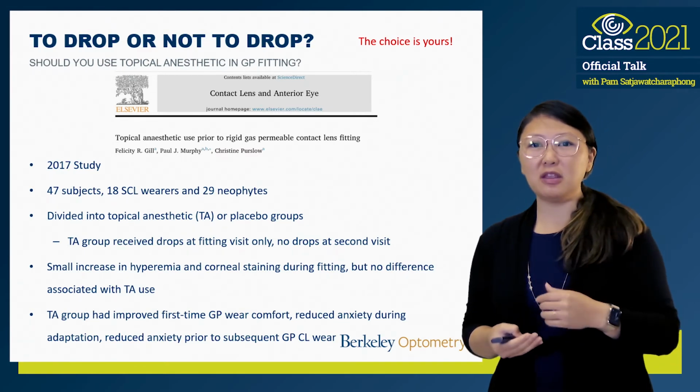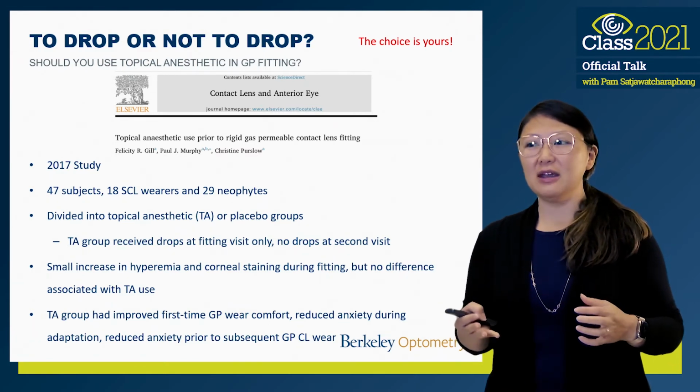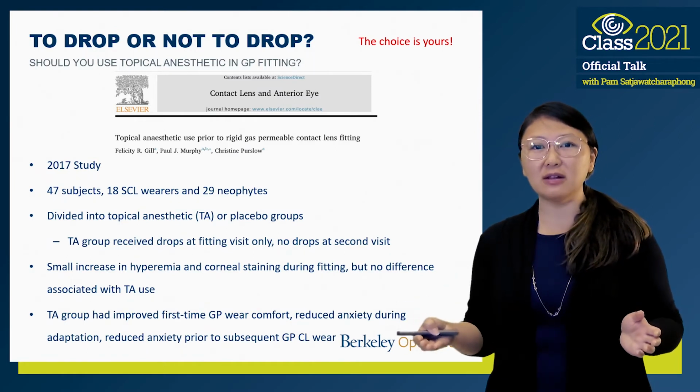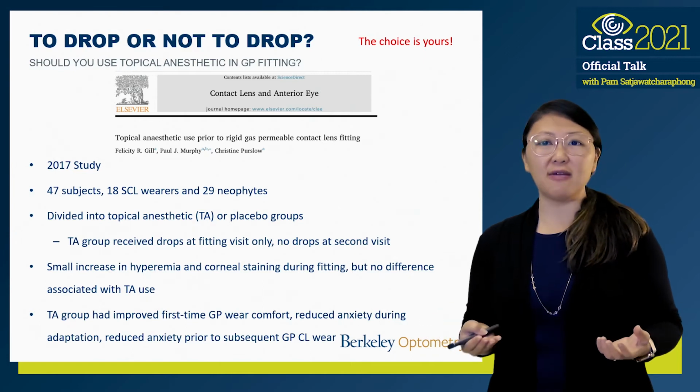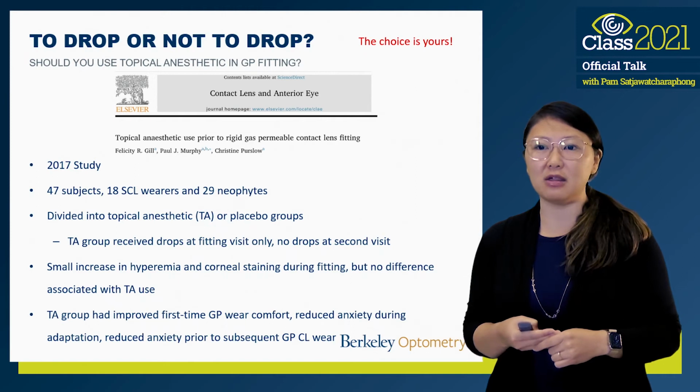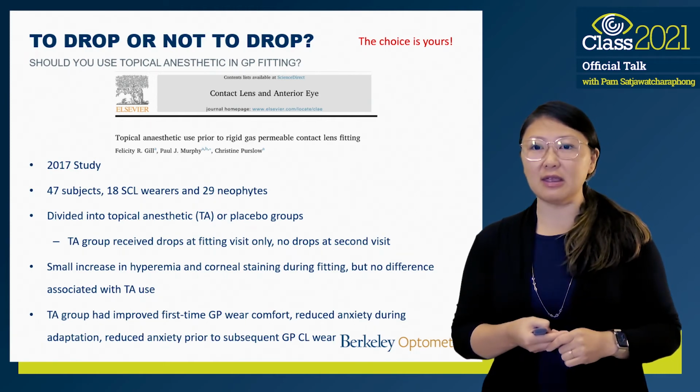And then she will put the drop in and say, this is sort of a fast, accelerated adaptation process where the hope is after you've worn the lenses for a while, you're no longer going to feel them on your eye. So this is what you can look forward to if you can get through that initial adaptation. And I thought that was a nice way of presenting it.